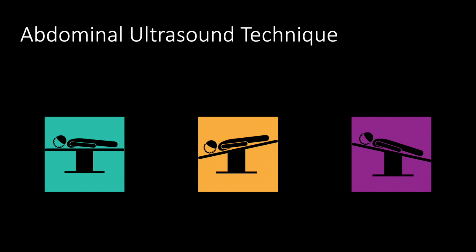However, every now and then you may want to place your patients in Trendelenburg or reverse Trendelenburg if you're looking for free fluid in the abdomen and the patient is hemodynamically stable and able to tolerate it. The reason for this is that, of course, gravity will bring free fluid closer to the diaphragm into the right pericolic gutter or over the spleen where it makes contact with the diaphragm, or help blood or fluid drain down into the pelvis to increase the sensitivity of each of those positions.